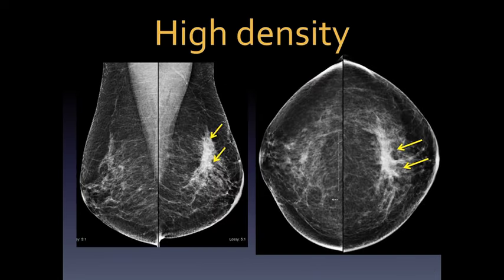The last distribution to consider is segmental — conforming to a pattern occupying more than one duct, in a duct or multiple ducts and their branches. It typically radiates toward the nipple with a segmental or triangular distribution converging on the nipple. This is a very suspicious descriptor associated with malignancy most frequently — over 70%. This was a high-grade DCIS.